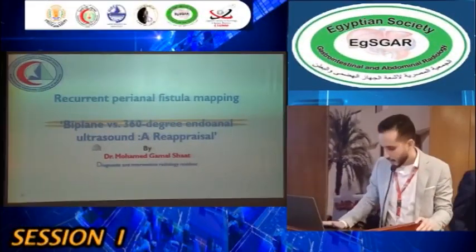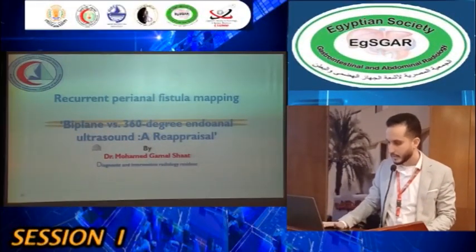السلام عليكم. النهارده هنتكلم عن recurrent perianal fistula mapping, biplane versus 360-degree endoanal ultrasound, a reappraisal.